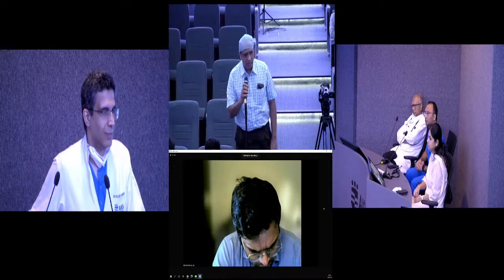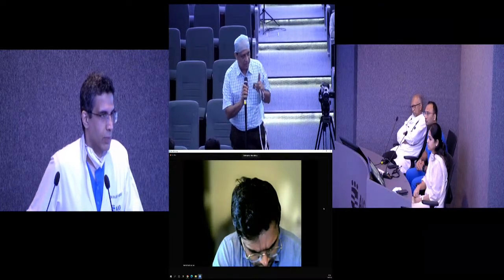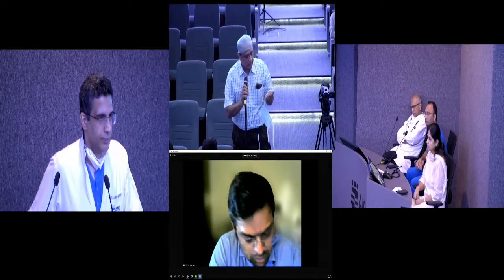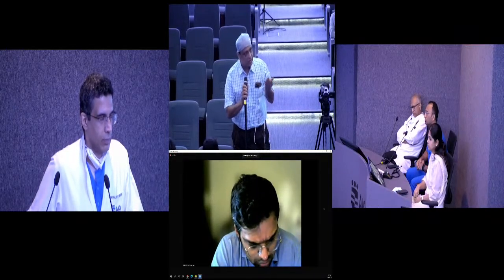See, I think it's a more scientific way of treating a patient with shock, putting in a SWAN. You're not only looking at the wedge pressures. You're going to look at cardiac output, you're going to look at cardiac index, you're going to look at systemic vascular resistance.